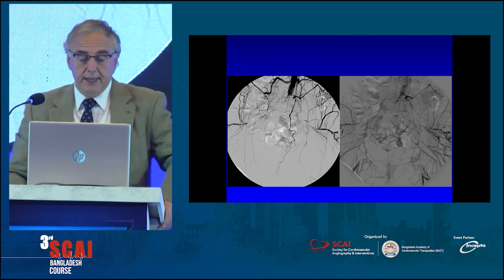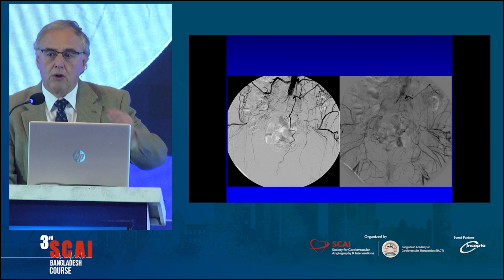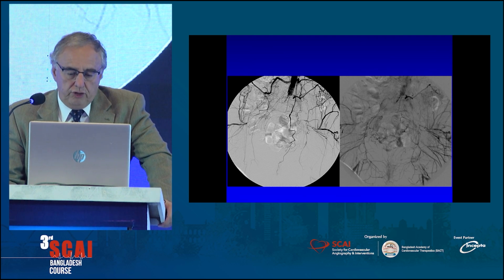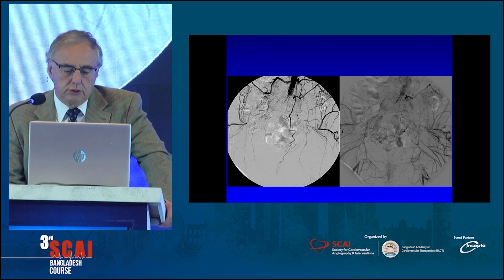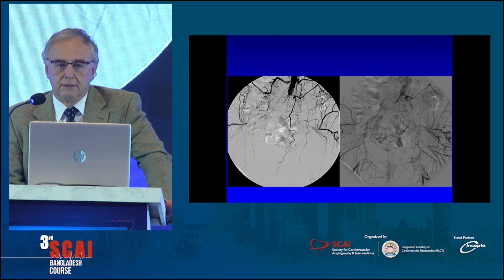I brought the patient in, and this patient had a completely occluded distal aorta. If you see here, you see the distal aorta, and there is reconstitution of the vessels below here. I know that she had a fem bypass, and I know that she has a right iliac stent.